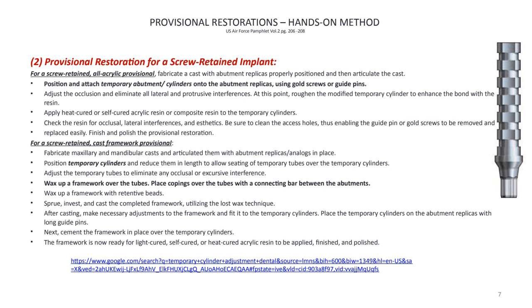On the buccal side or the facial side, we want to have the connection a little thinner to have a little design. So when we apply the acrylic to build up, it gives the illusion that the teeth are separated. So it looks more natural.